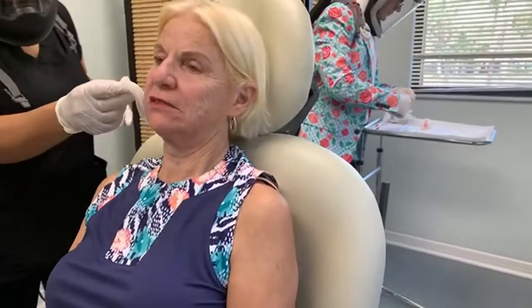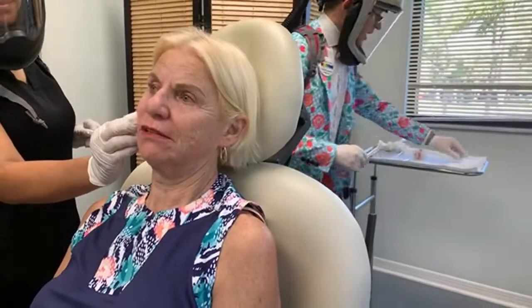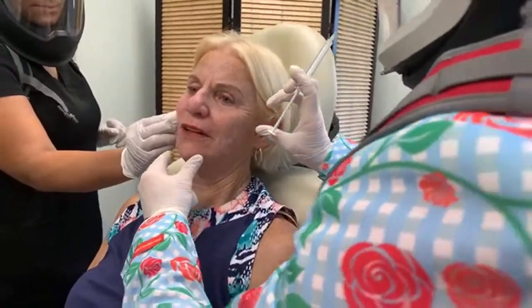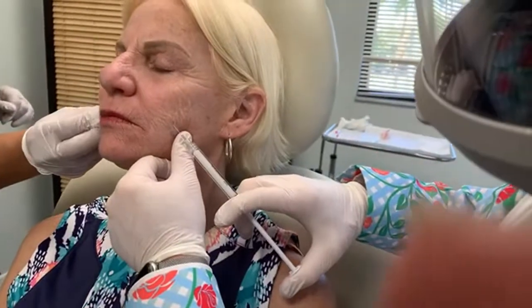Cindy, if you could just squat here for me, please. You see the difference? Really? Looks amazing. It's amazing. So Donna is going to pass the grocery store test today. If she walks into the grocery, no one does a double take. Let me turn your head this way a little bit. So we're going to focus on some of these deeper creases.